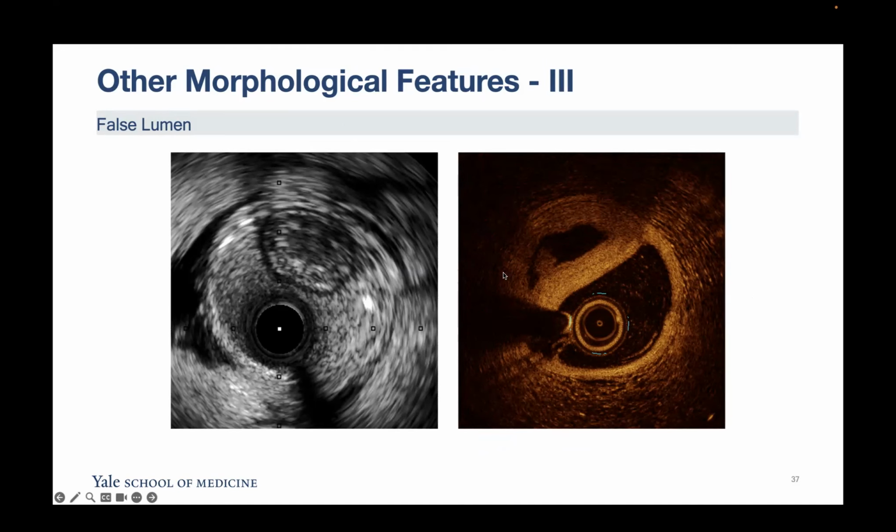So I did one study that we are finishing the manuscript for right now. I took a pressure wire, a regular FFR wire, and I measured the intracoronary pressure during injection in 5 positions along the vessel: the distal position, mid position, proximal position, at the catheter ostium, and inside the catheter. What we found is that when we hand inject, we generate a lot of pressure, usually above 300 millimeters of mercury inside the catheter. But once the contrast exits the catheter, it dissipates in the aorta.